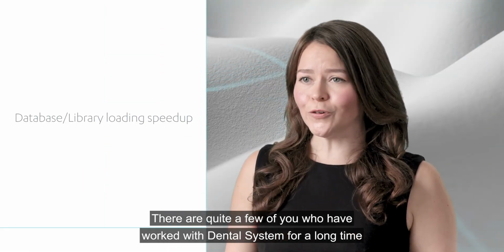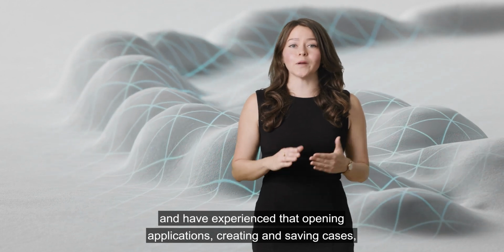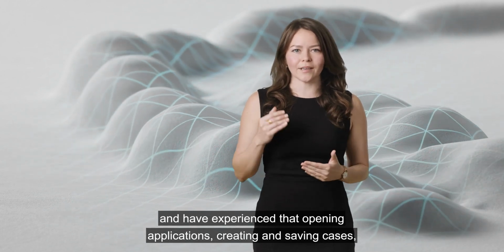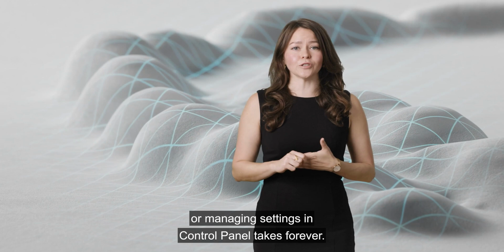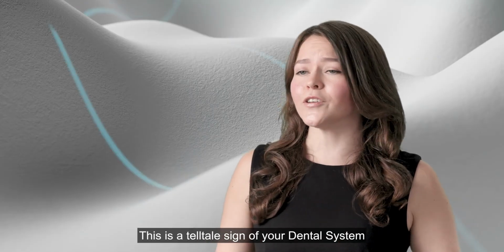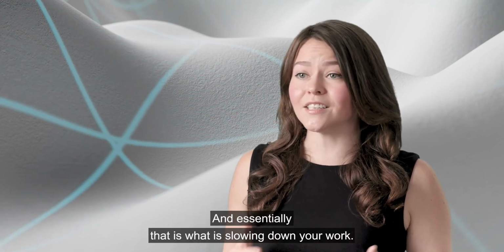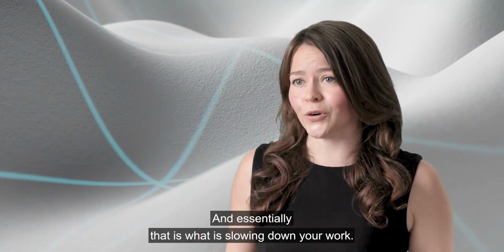There are quite a few of you who have worked with Dental System for a long time and have experienced that opening applications, creating and saving cases, or managing settings in Control Panel takes forever. This is a telltale sign of your Dental System material and library database being enormous, and essentially that is what is slowing down your work.